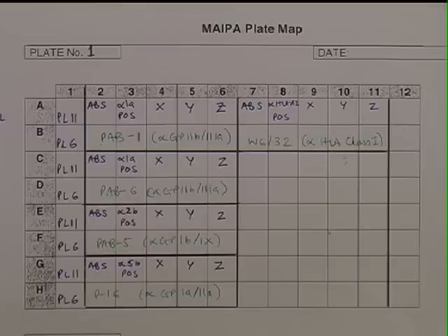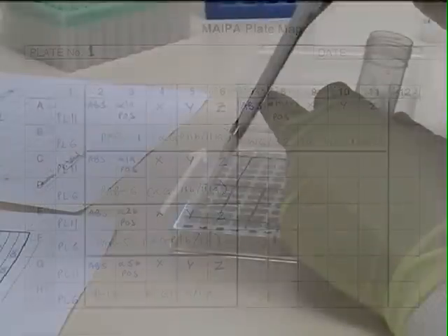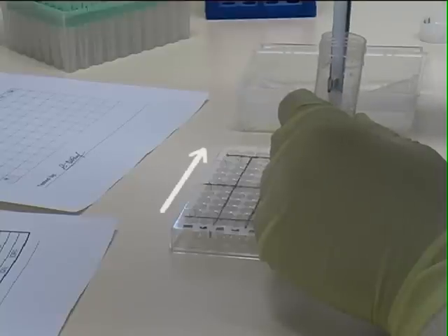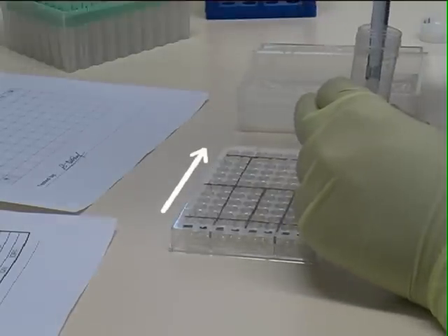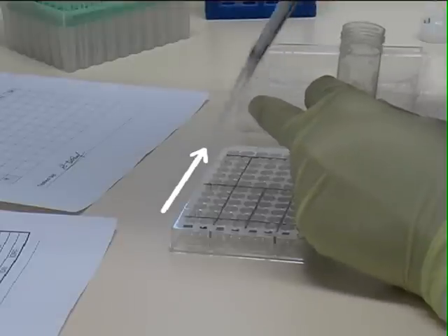If we find an antibody reacting with these screening cells, then we would carry out more tests with a larger panel to identify its specificity. To start the assay, we add platelets to the plate, spin them down, discard the storage buffer and resuspend in TBS BSA buffer.